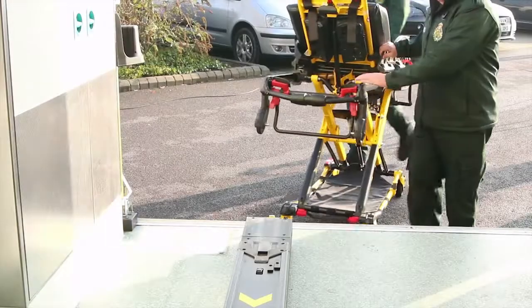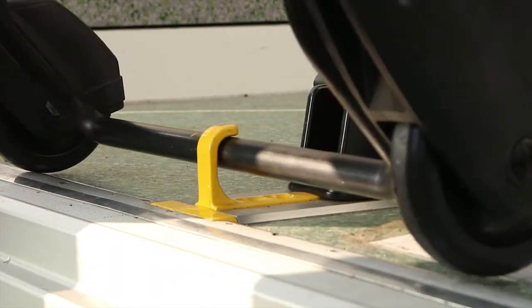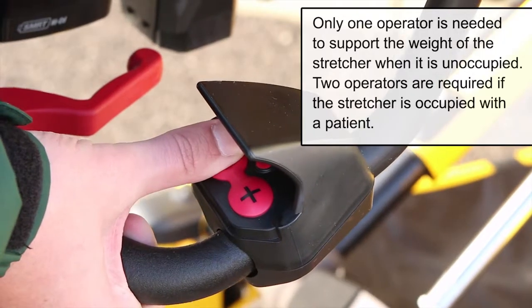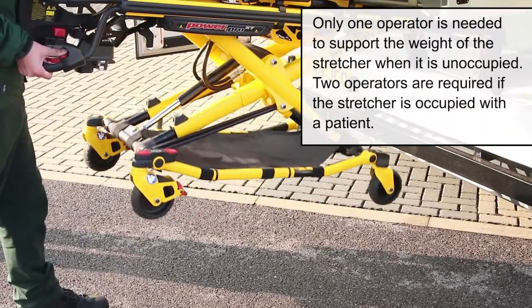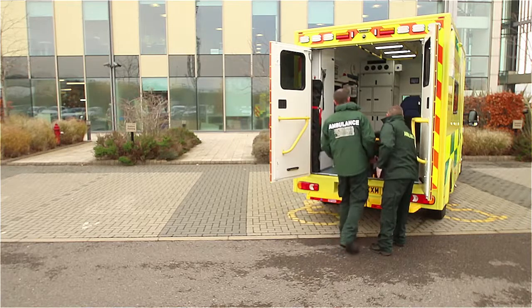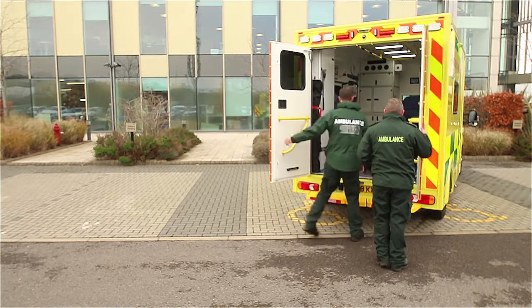Loading the stretcher: operators need to line up the stretcher with the safety hook in the vehicle, and one operator needs to support the weight. Press and hold the minus button on the control panel of the stretcher to retract the legs. Push the stretcher into the vehicle along the PowerLoad transfer until it comes to a complete stop and is locked into position automatically.